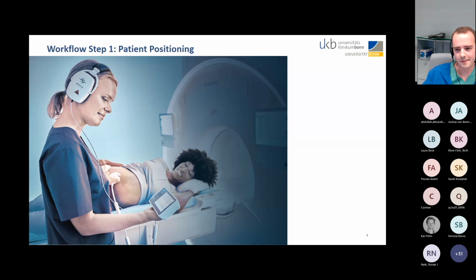At first, it is more comfortable for most women, especially when it comes to claustrophobia. It prevents vena cava compression syndrome, and lastly it makes it easier to find the fetal heartbeat and to fix the transducer on the abdomen.